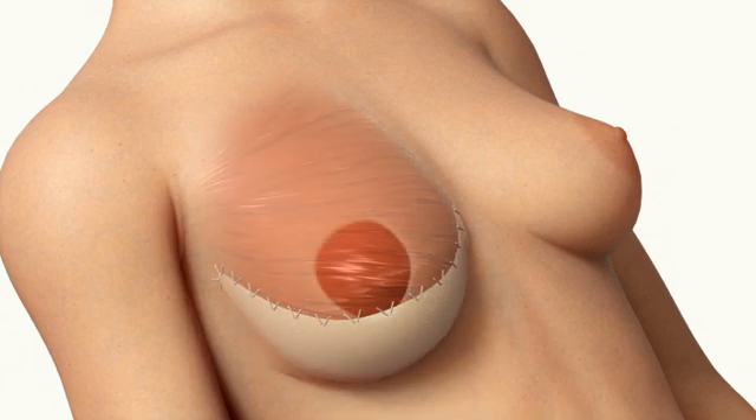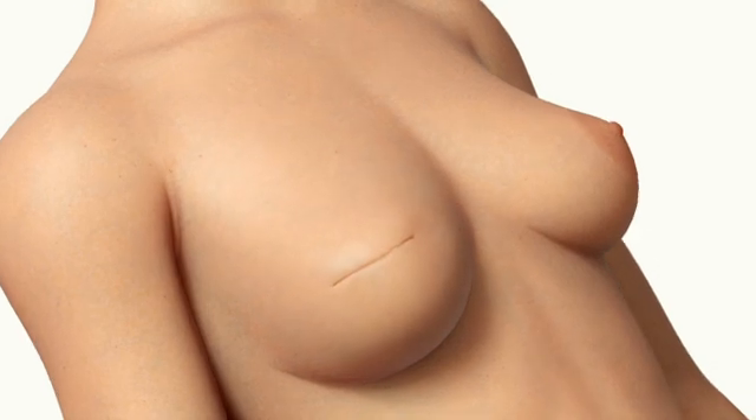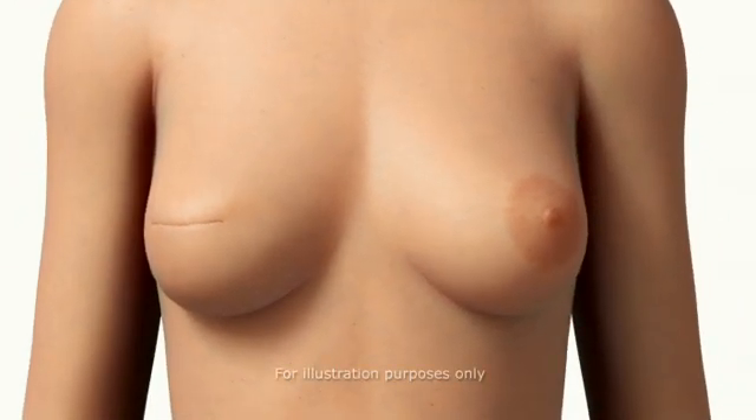Alloderm Tissue Matrix can help recreate breasts that are more natural-looking and feeling than traditional breast implant reconstruction techniques. Alloderm Tissue Matrix may also lessen the potential of developing other future complications that can occur with breast reconstruction surgery.